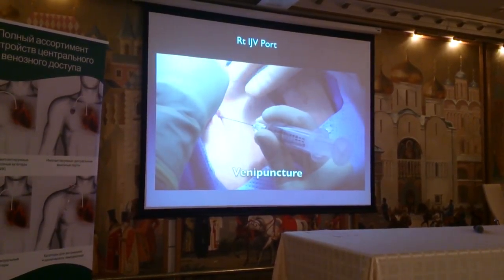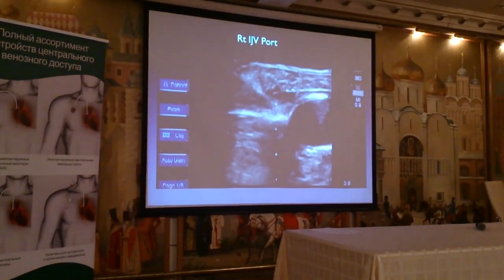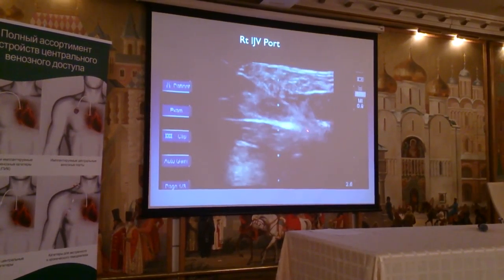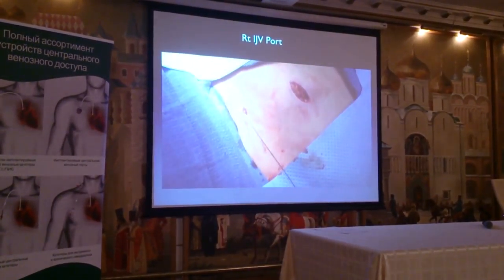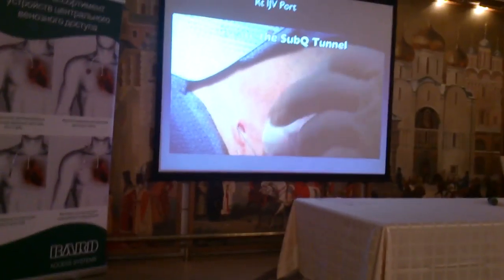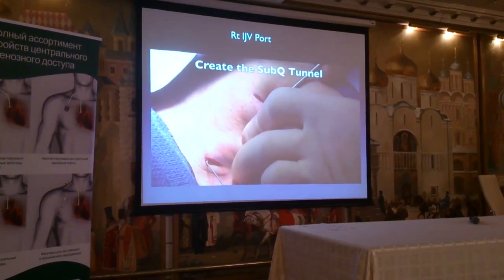Here's my second incision in the neck. We're going to guide the needle with the ultrasound in-plane into the jugular vein, aspirate blood, and put the guidewire. At this point, we're going to tunnel the catheter from the chest up to the neck.